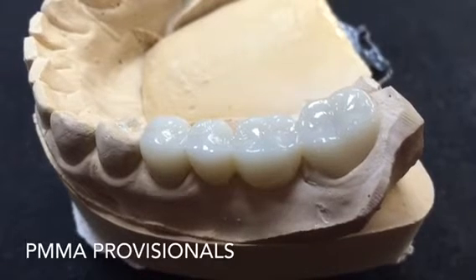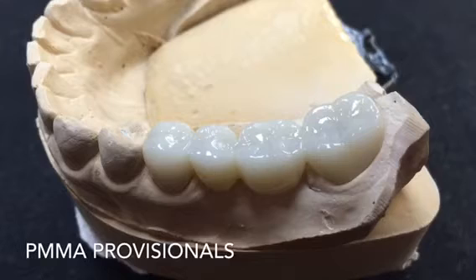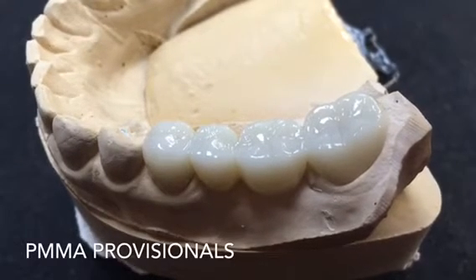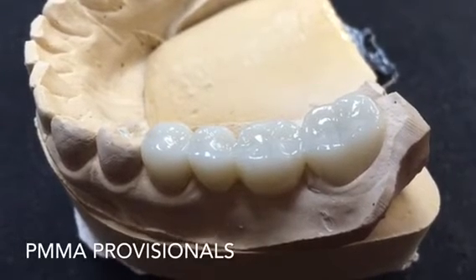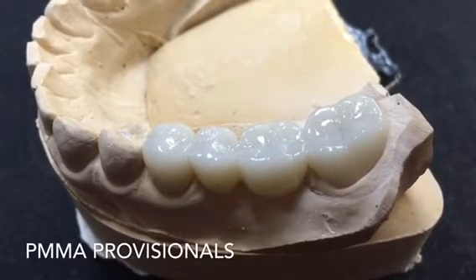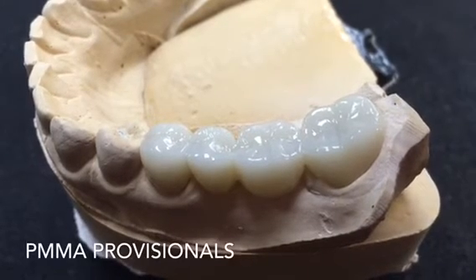What you do is pull a traditional impression, or actually scan the dentition with one of your chair-side digital scanners. These files are then imported into their design software where they can go ahead and design the provisional itself. It is then sent to a mill, and out of a puck of PMMA — polymethylmethacrylate material, which is a very, very hard acrylic material — they can mill the provisional restoration for you.